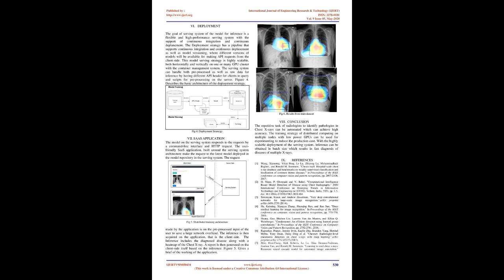The gradients get lost midway while back-propagating, thus making the later layers not fine-tune. DenseNet solved this problem with skip connections, making gradients reach the later layers too, making DenseNet a great choice for building deep models for learning complex features in the field of medical imaging.